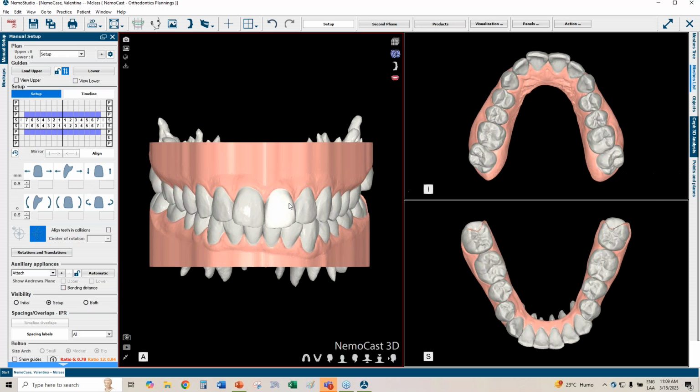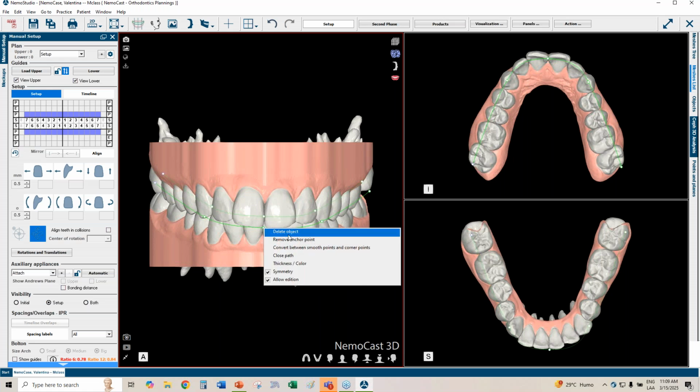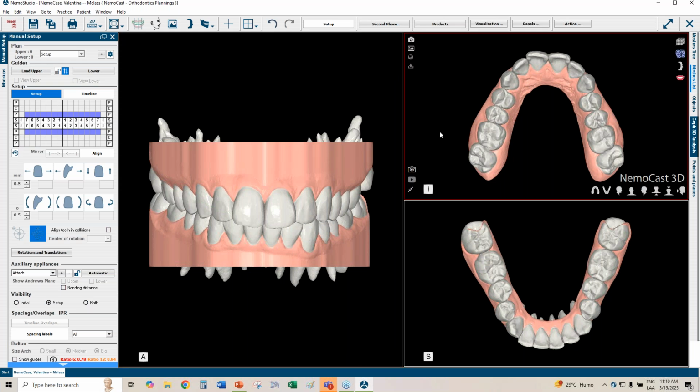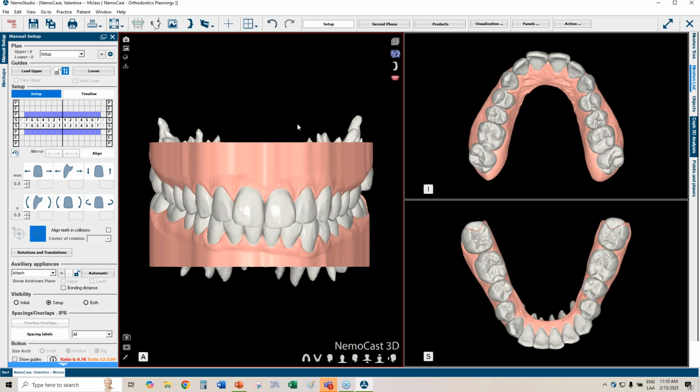Normally, if you're just going to use the orthodontics, sorry, I'm a little out of place because I forgot I had to do this. Okay, normally if you're only going to use STLs for the case, you have some information. Obviously, you should try and use it with the x-rays and everything.